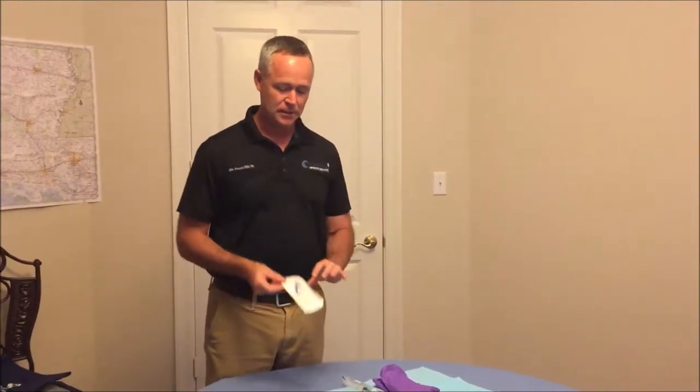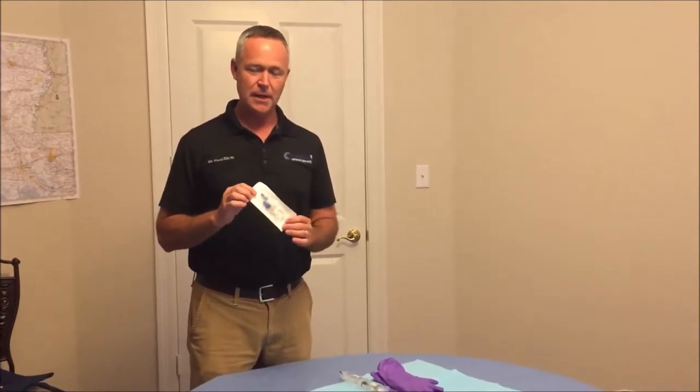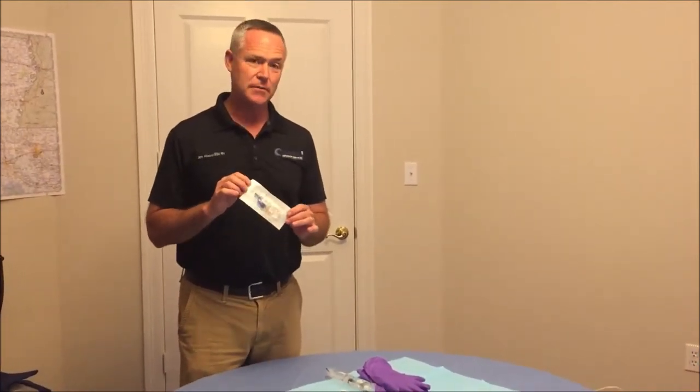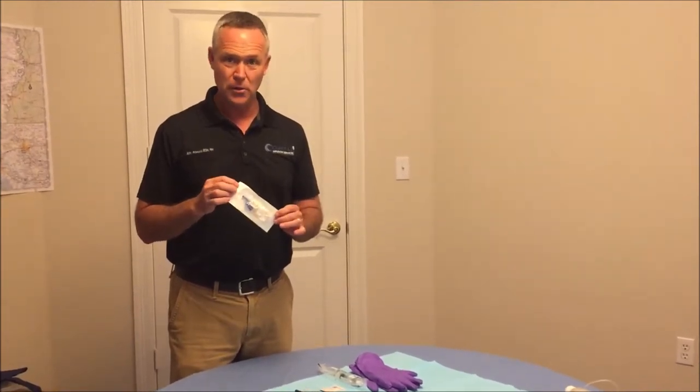Hello, my name is John Atwood with Coastal Infusion Services. Today we're going to show you how to hook up a 14-inch extension set to your PICC line. This is going to be for patients that may not have a caregiver there to help you administer your medication every time. But in order to connect this to your PICC line, you are going to need a family member, a friend, or your home health nurse to assist.